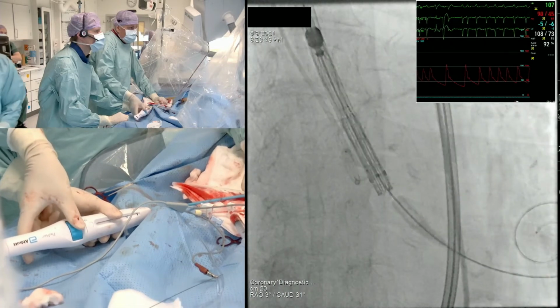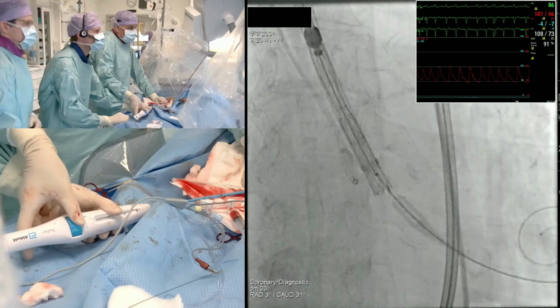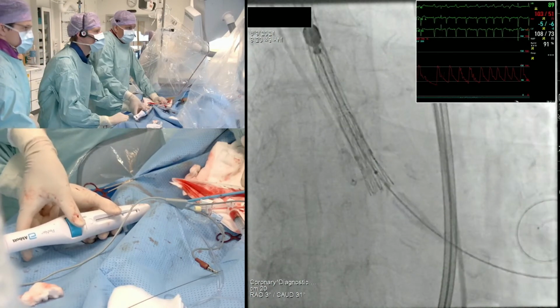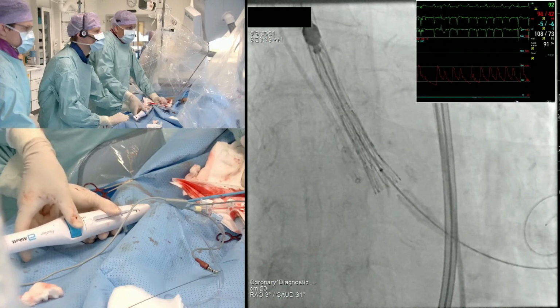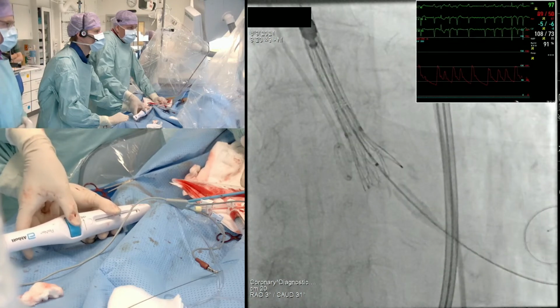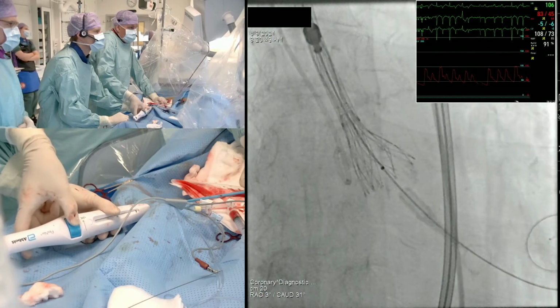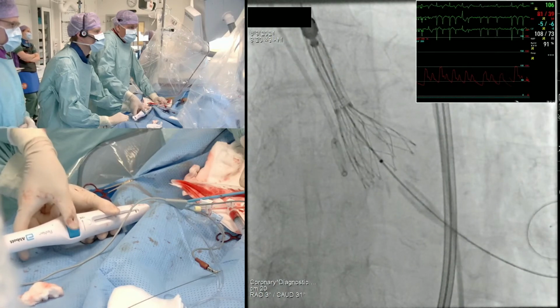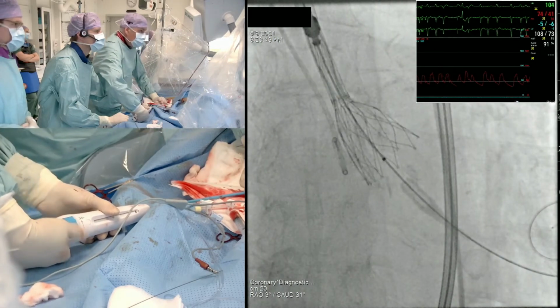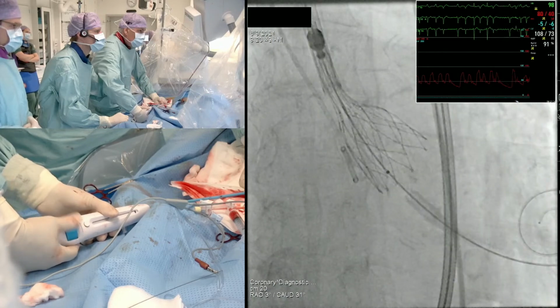It's now halfway up to the first intersection. And here at the first intersection is the position where it starts to flare out. I think it's sitting very stable here, and we're not doing any pacing. It's an intra-annular position of the leaflet, so often you don't see any compromise on hemodynamics, which is of course also important in this case with a patient with severely impaired LV function, that you don't need to do rapid pacing or long time pacing here.